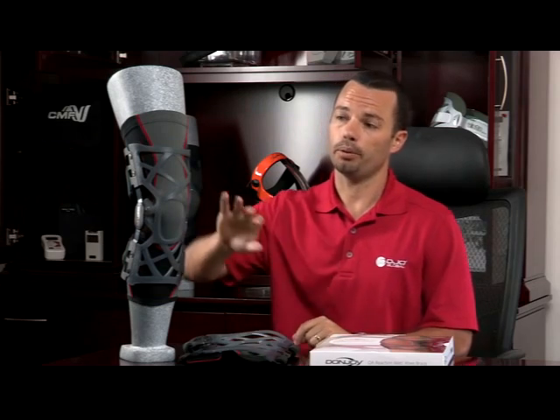Hi, I'm Nick Gomez. I'm the Global Product Manager here at DJO Global, and I'm here to talk to you about the new and exciting OA Reaction Knee Brace.